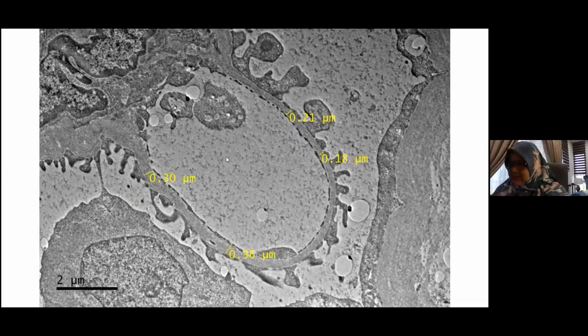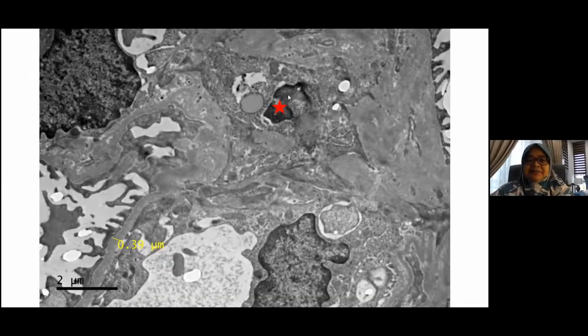I think in this case the average thickness was, can't remember. It is normal. The average thickness was normal. All right, we can see some apoptotic body or debris.